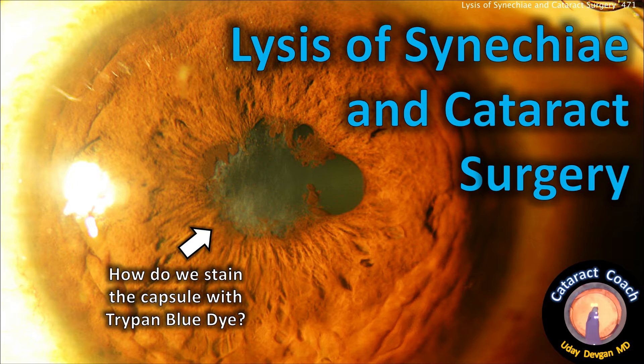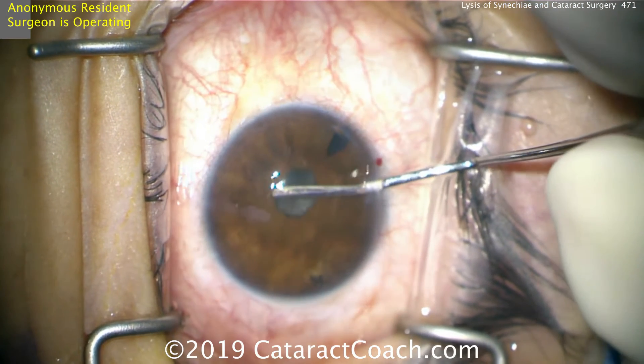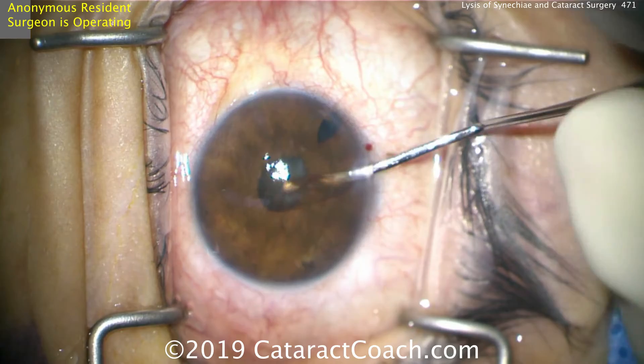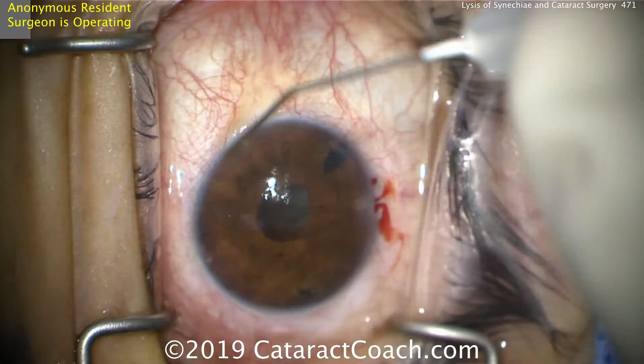CataractCoach.com — lysis of synechiae and cataract surgery. How do you stain the capsule with TriPen Blue dye when there's so much synechiae? The first step is a paracentesis, then use a spatula or some other smooth, blunt instrument to separate, in a circumferential manner, the iris attachments to the anterior lens capsule.